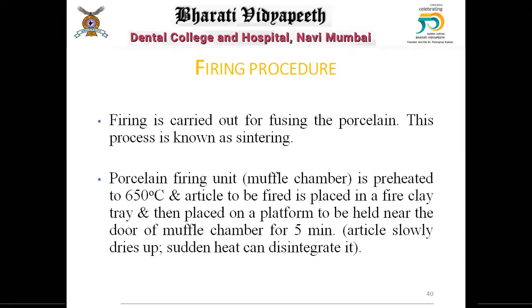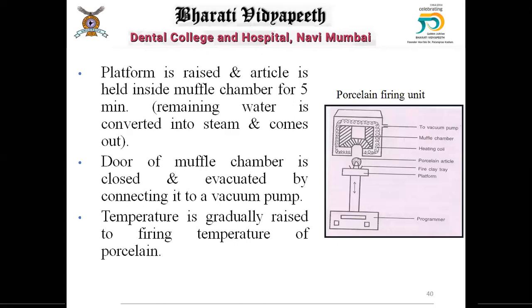So then the firing procedure. So firing, or sintering, you can call it. Once you have made the structure, it is placed into the furnace. The furnace has a platform. So on this platform, you place the article.